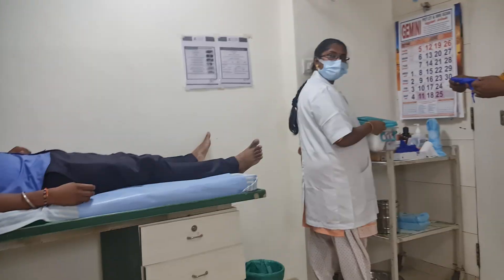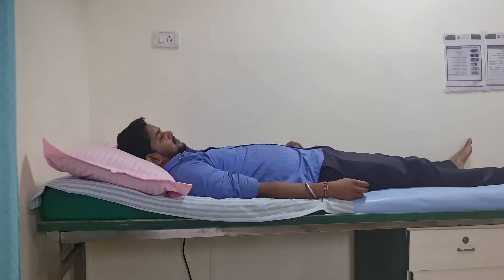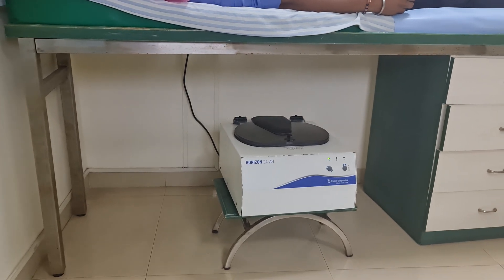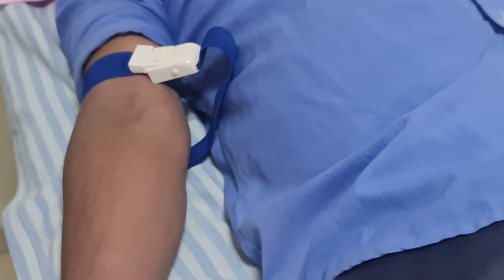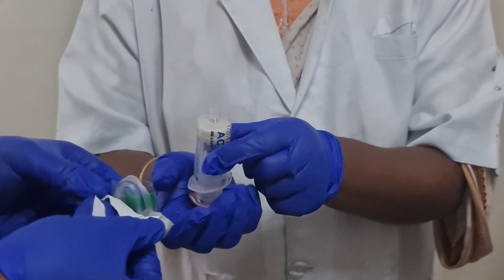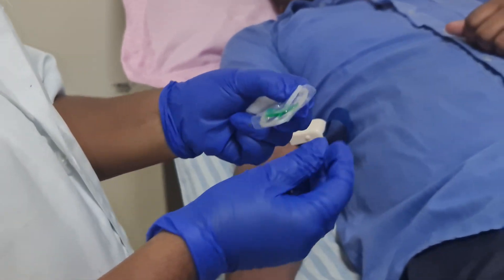Let's see the procedure now. The patient is lying on my couch and the phlebotomist is here. We are going to aspirate 15 ml from his vein. This is the centrifuging machine over here. A small tiny butterfly needle is used — 21 gauge — so there won't be any pain. She has the ACP syringe connected to it.